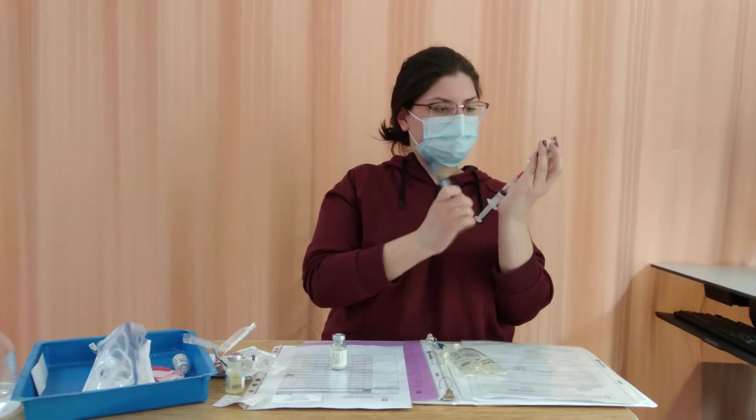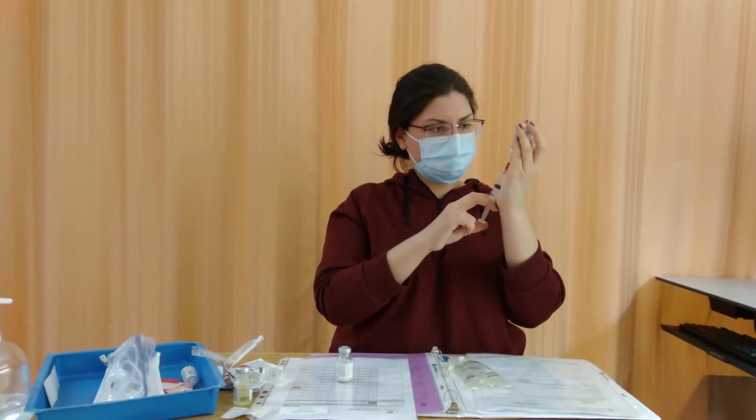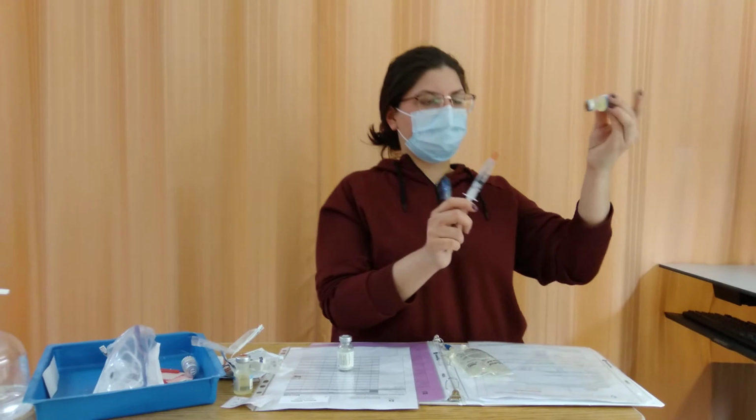Clean it for 30 seconds. So I'm going to write 15. Then I'm putting it at the end of the table, making sure I don't contaminate it. Okay, so 3.4.